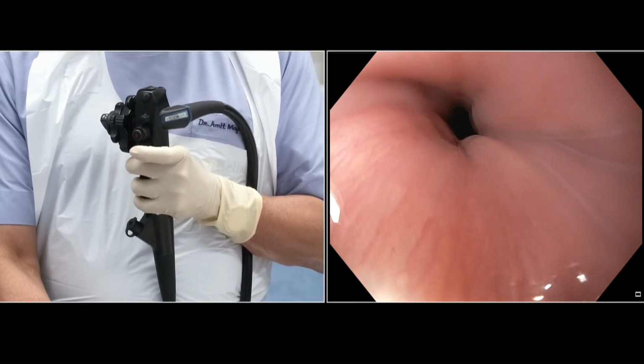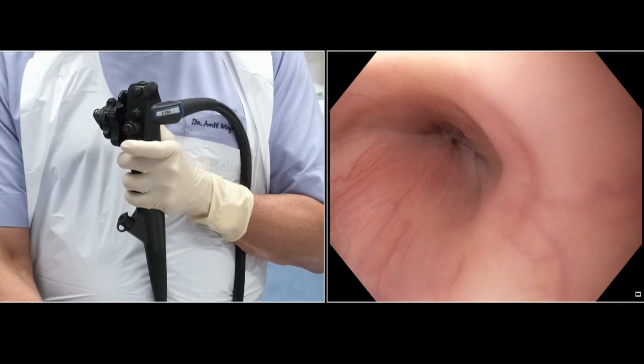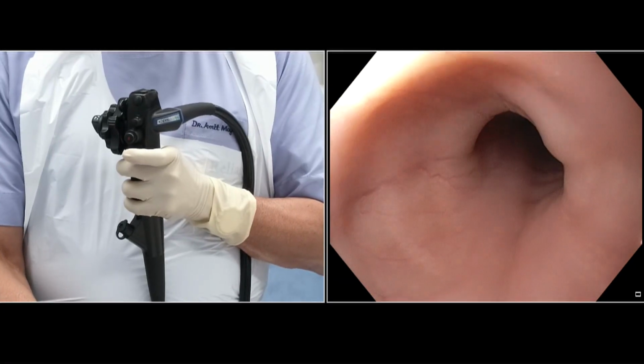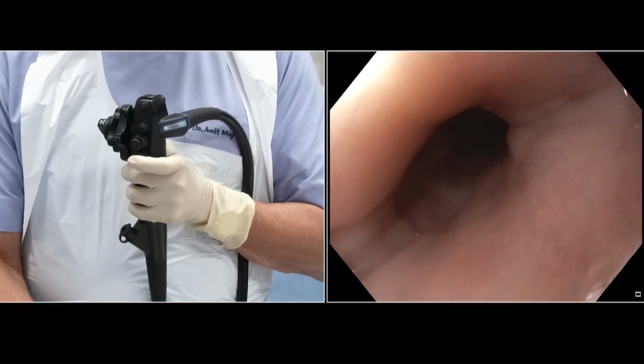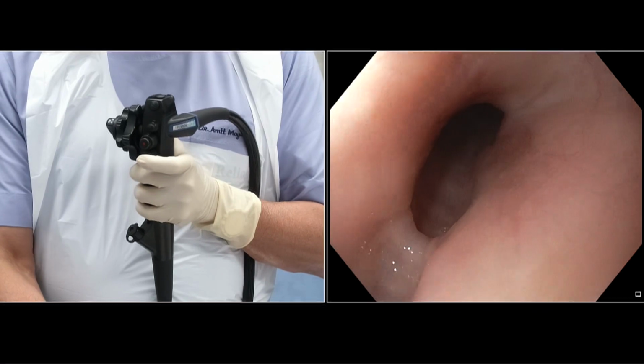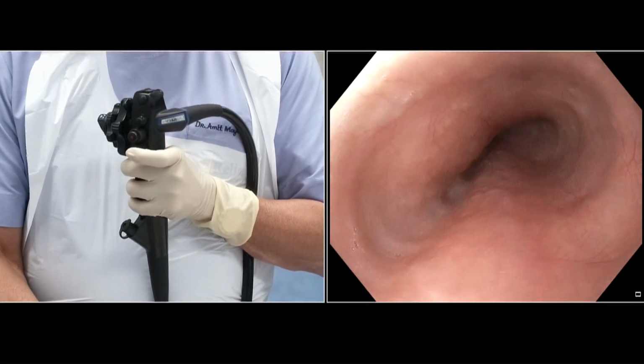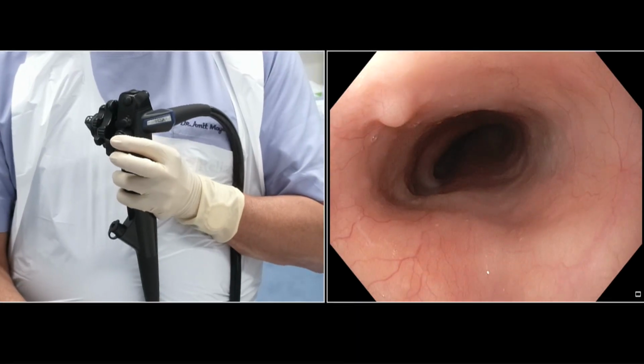Here you can see that there is no Barrett's with the NBI, and then pulling back the scope, once again visualizing each and every part of the esophageal mucosa, making sure that this vascular pattern is normal and there are no pathologies inside the esophagus which require a biopsy, and gently pull the scope out. If there is any secretion, keep on sucking it.